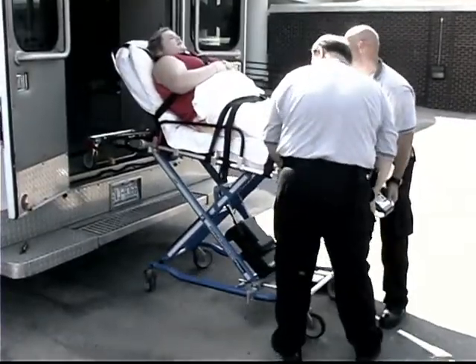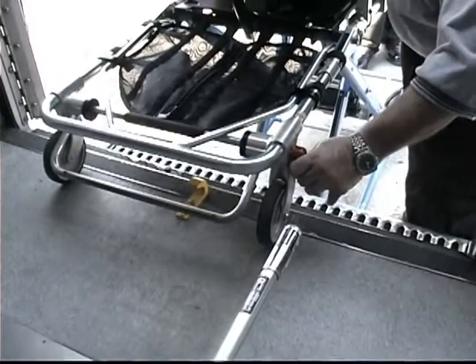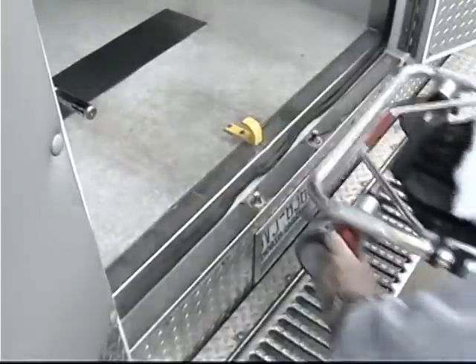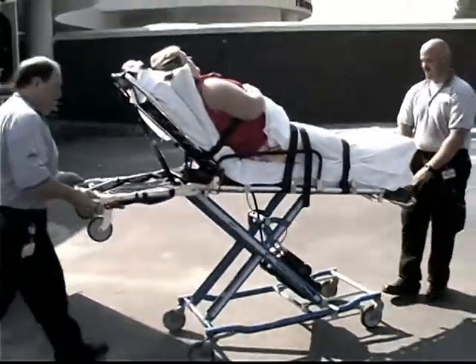The assisting operator then moves to the head end of the cot and lifts the red fastener release handle to release the safety bar from the safety hook. Roll the cot completely out of the ambulance and lower the cot to a rolling height.